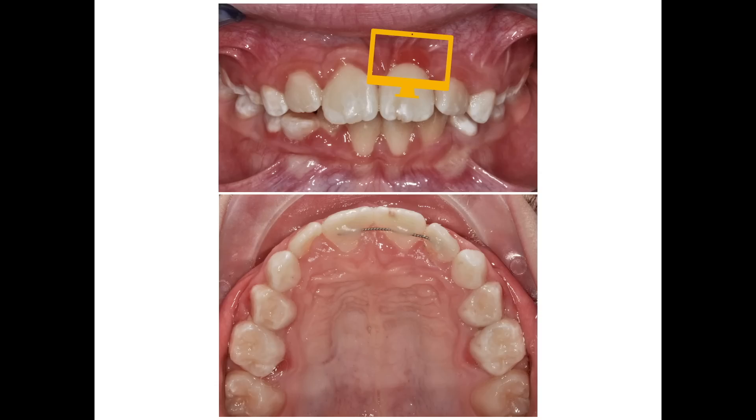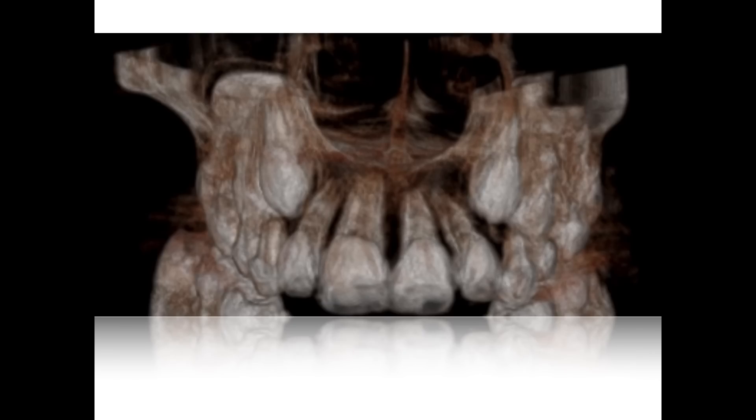One more thing. Just to make sure that 21 stays where we put it, I splint it with the adjacent teeth, waiting for Jane's permanent dentition to complete. As we can see from the control CBCT, the incisor's apex is still forming and it did not deform because of our tractions.